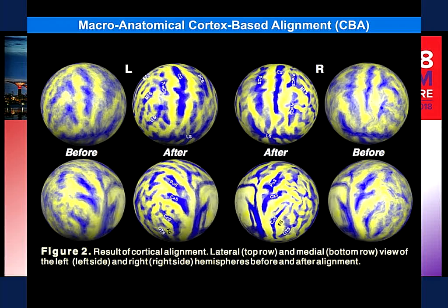It looks a bit washy here, because this brings standard MNI or Talairach aligned brains onto the same sphere, so several of them form a probabilistic curvature map. If we then do the cortical alignment, it means we move the sphere such that the corresponding curvature is maximized, and then we go back to 3D. It now looks almost focused, as opposed to unfocused, and that's the benefit of cortex-based alignment.